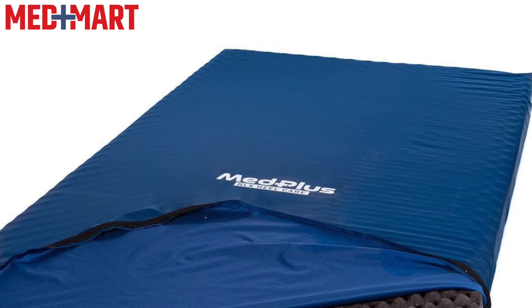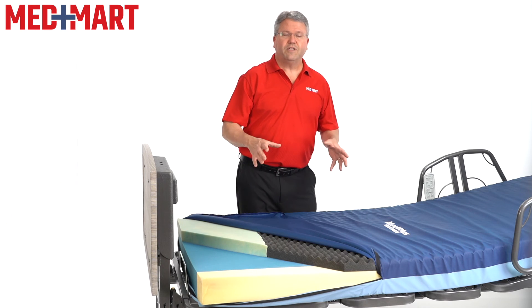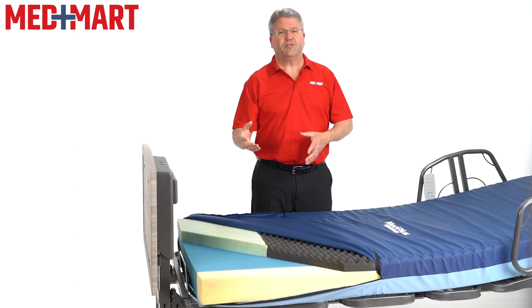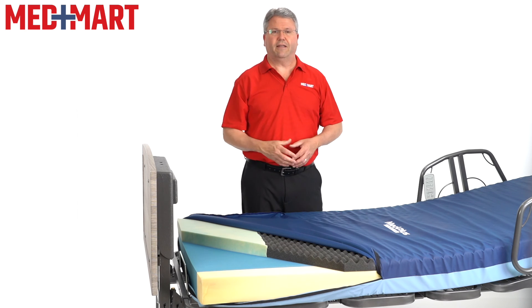Because the cover is waterproof, it makes it really easy to wipe down on a daily basis and take care of someone at home. This mattress will also come to you in a 14 by 14 inch box, in either 36 or 42 inches in length. That makes it really easy to bring into the house and set up on your home care bed without having to bring a bulky box inside.